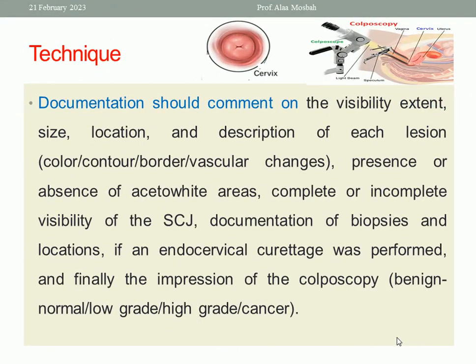Then documentation is very important and should comment on the visibility extent, adequate or inadequate, and the size, location, and description of each lesion. What about the color, contour, border, and vascular changes? Then, presence or absence of an aceto-white area, complete or incomplete visibility of the squamocolumnar junction, documentation of biopsies at their locations, whether an endocervical curettage was performed, and finally, the impression of colposcopy: is it benign or normal, low grade, high grade, or invasive cancer?